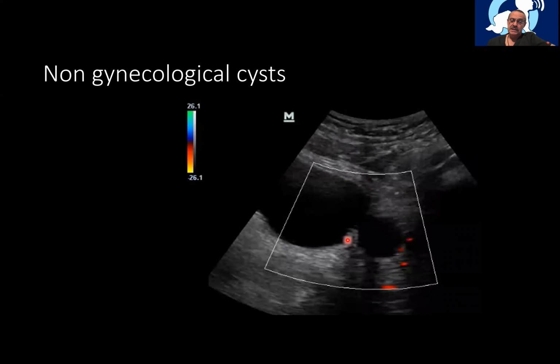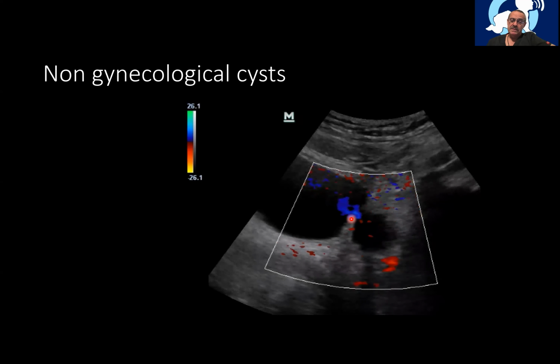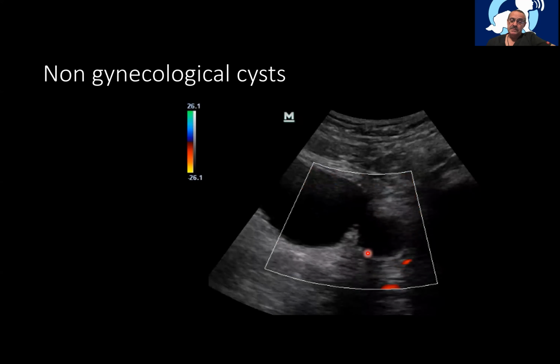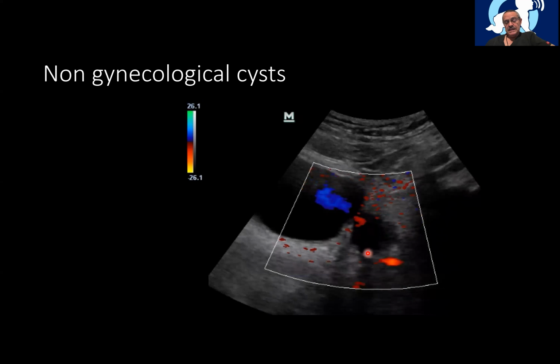See that? Beware the flow. See that? Again. Ultrasound is clinic information because number one is bedside examination and number two is a prolongation of your sight. You're looking at things. You're not inventing things.